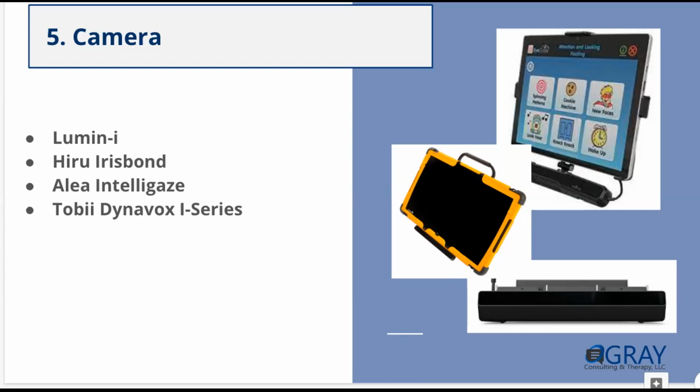The other thing that does change slightly from camera to camera is the angle that camera is mounted at the bottom of the device, and that can also impact where you're positioning the device, and that might also improve an individual's access. And again, some cameras do better with those bright lights and being outdoors, and some don't. So I would say that I'm dumbing down the number of years that I've worked now.